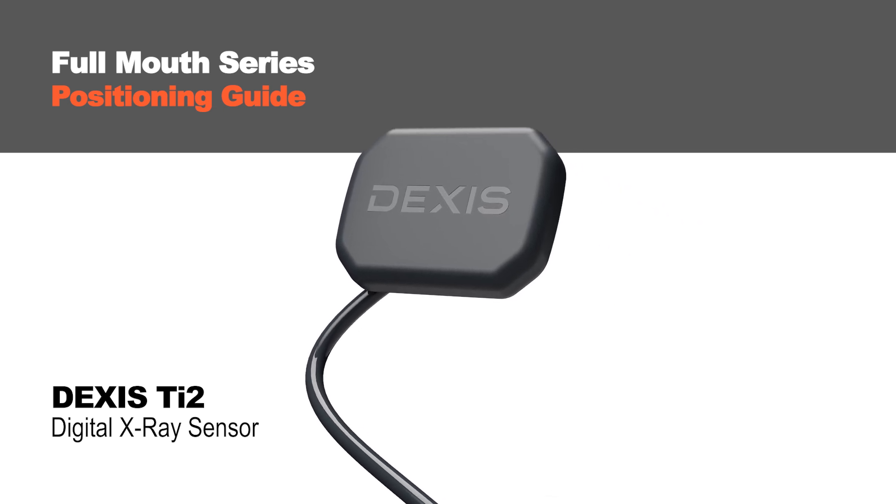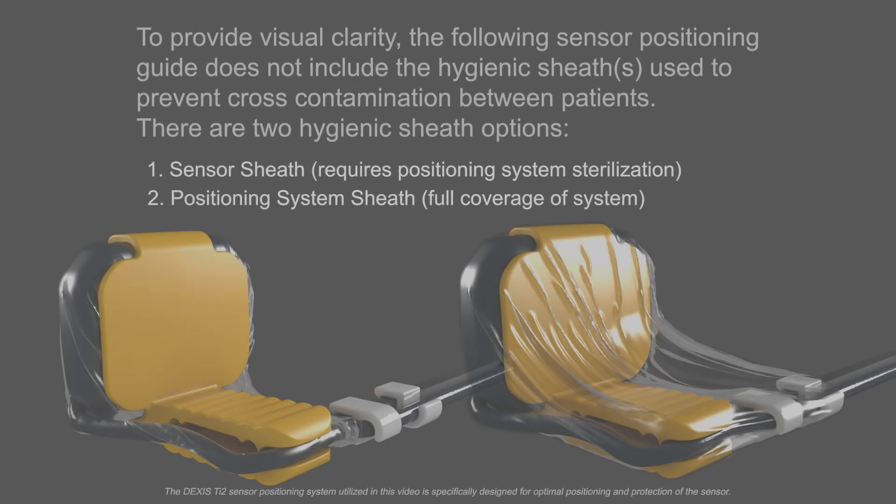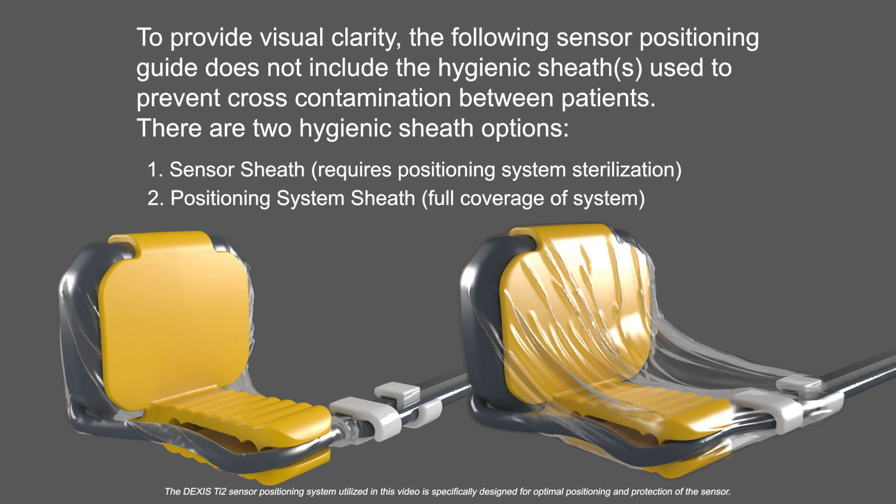Welcome to a guided tour of a full mouth series using the DEXIS TI2 sensor. To provide visual clarity, the following sensor positioning guide does not include the hygienic sheaths used to prevent cross-contamination between patients.